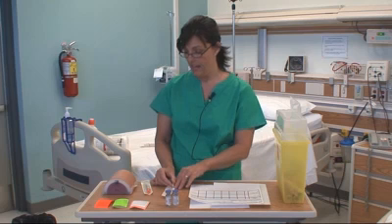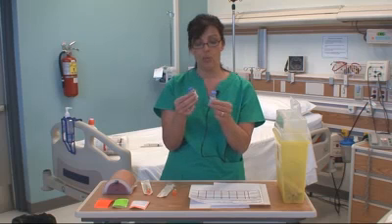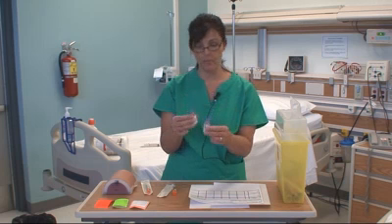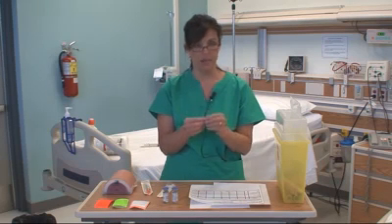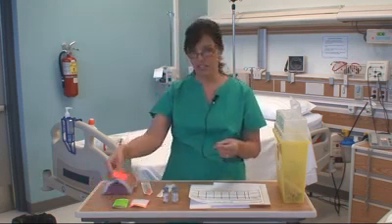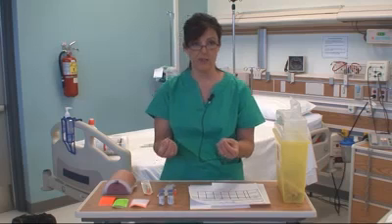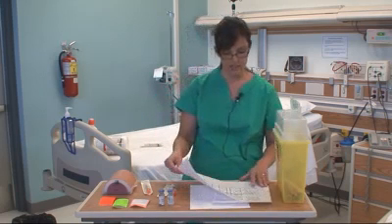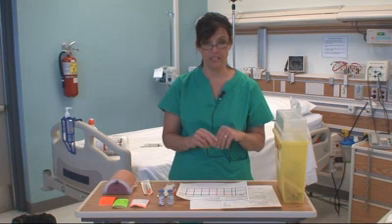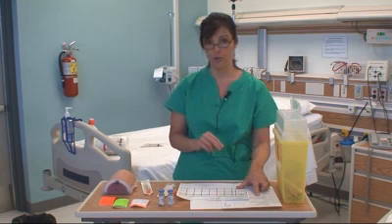In addition, because we're going to use these brand new bottles, once they are open, they're only good for a 30-day window of time, and they need to be labeled with the date and the time as well. Okay, so we've got various labels here. As per the agency policy, we would put the date and the time that those bottles were opened, and they would be refrigerated. Again, just to recap, we are going to give 40 units of Humulin N, and according to the sliding scale, an additional 4 units of Humulin R.